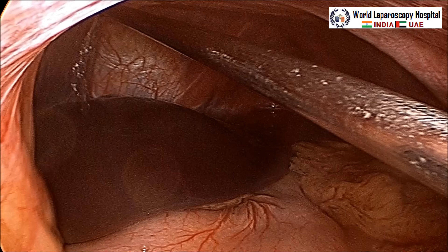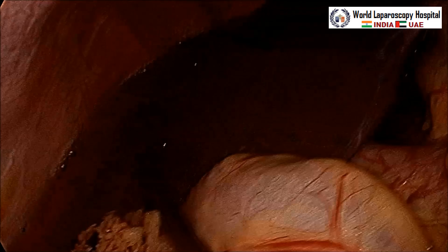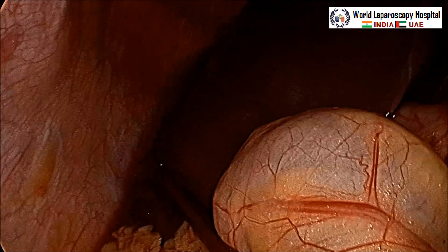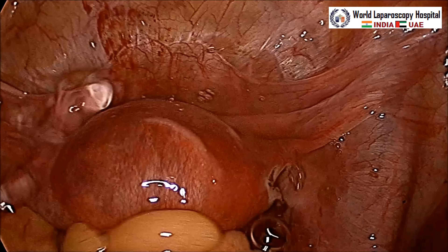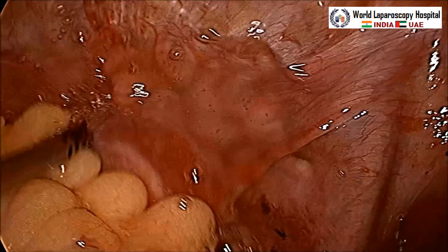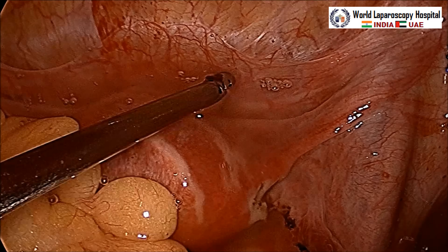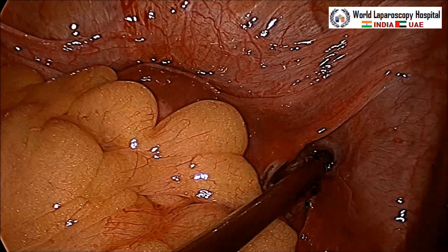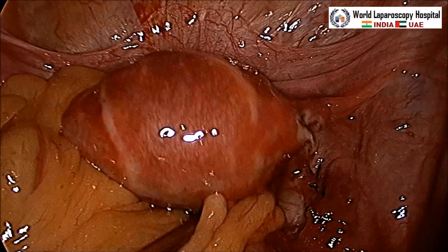For any pelvic surgery with bleeding, upper abdominal cleaning is necessary. If you have clots in those areas, use heparinized saline — 5,000 international units of heparin diluted with 500 ml of normal saline — to clear the clots. Now coming back to the pelvis, put the patient's head up so all blood collects to the pelvis. Wash the anterior cul-de-sac and posterior cul-de-sac thoroughly. At the end of surgery, you may leave 200–300 ml of fluid to prevent adhesions.